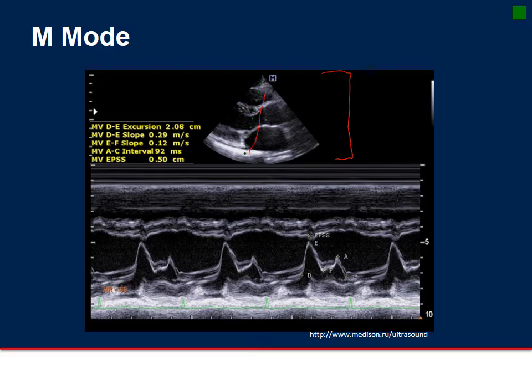And this is a picture of the heart in a parasternal long axis view that's focused on the mitral valve. So as the heart beats, the mitral valve opens and closes, and we can see how that opens and closes over time. So when we look at our M mode, over time, it gives us this opening of the mitral valve and approximation of the mitral valve to the septum, and then coming back down, and then with the next beat, it goes back up. And so over time, we see the motion of tissue that's within the line on our 2D ultrasound image.